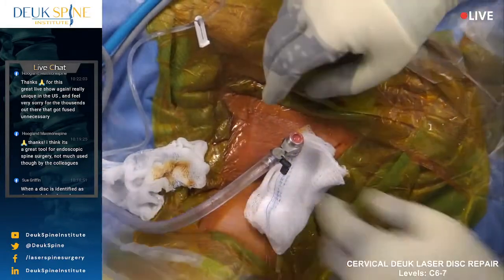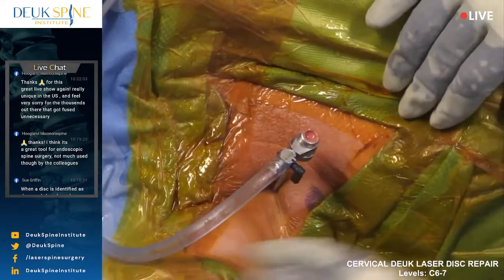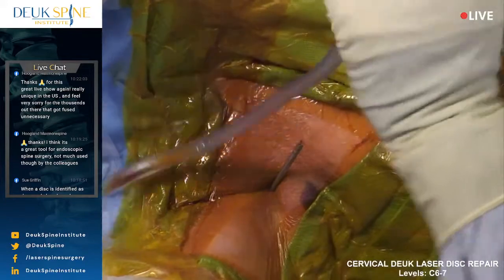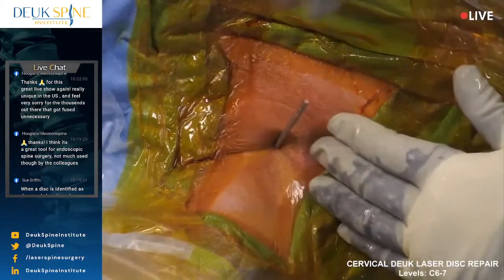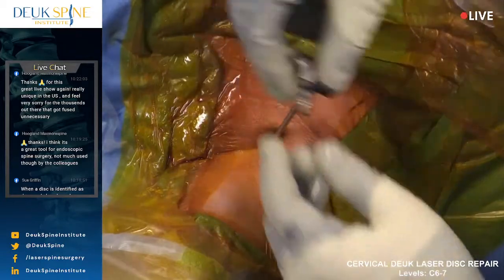All right, let's see what we've done here, Diego. Can you see? Yes, we can. This is his face, his neck, his Adam's apple, his shoulders and chest here. I'm going to take this fluid adapter off so you can see. The whole surgery was done through this tiny little tube right here. You see that? Diego, I don't hear you. Yes, we see it.